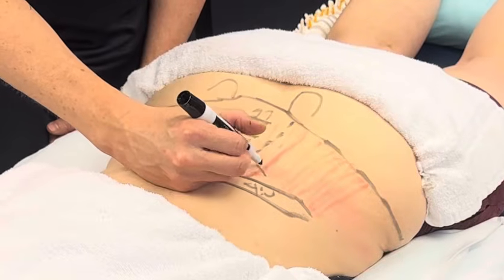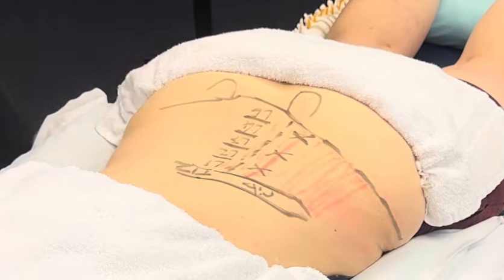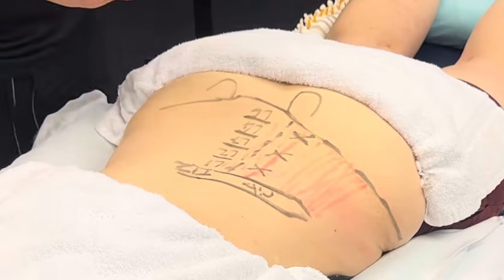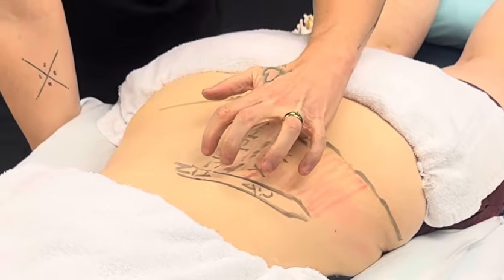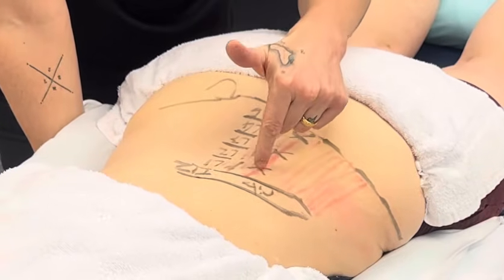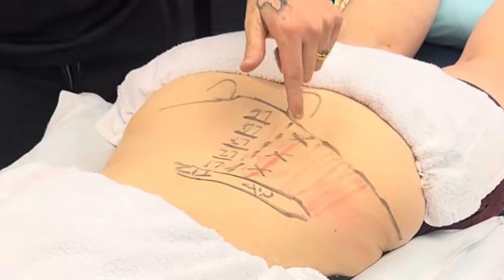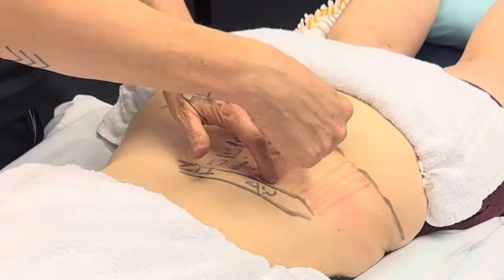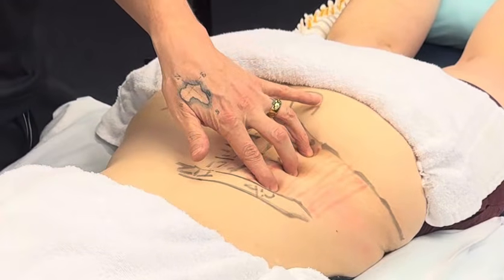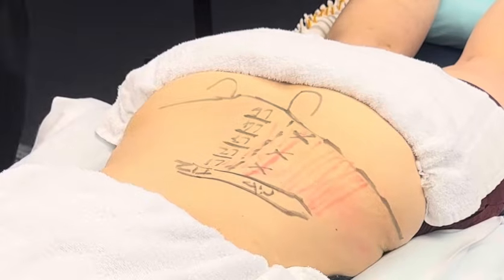So I usually needle. Patients can have a whole spasm of the whole thing, or they might have a tender point at 1 or 2 spots, right? So if they have a tender point, hit it. Otherwise, you could just needle paraspinals once, that's good enough. Or if you wanted to do 2 or 3 spots along in there, that's fine too, okay?